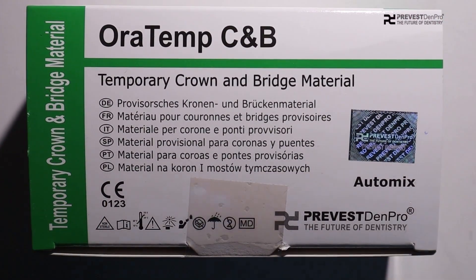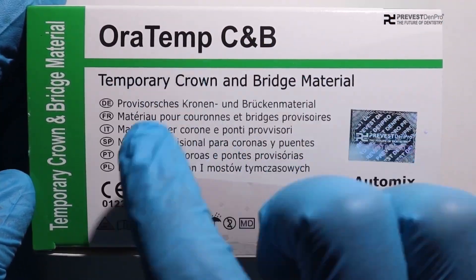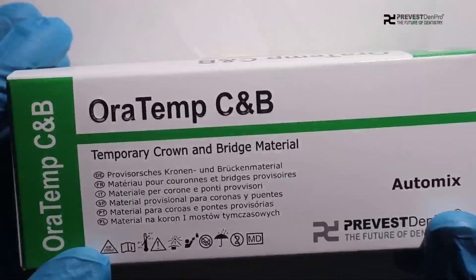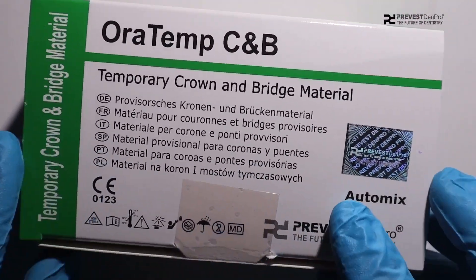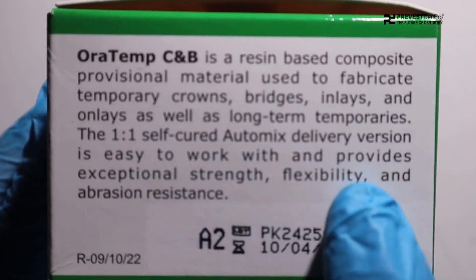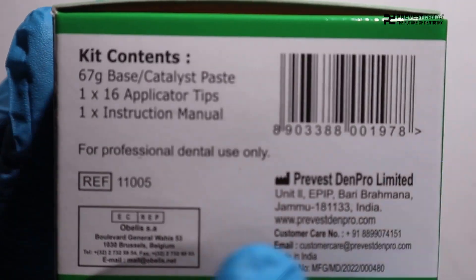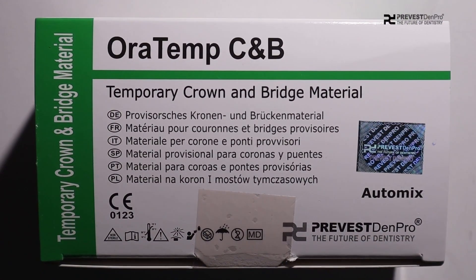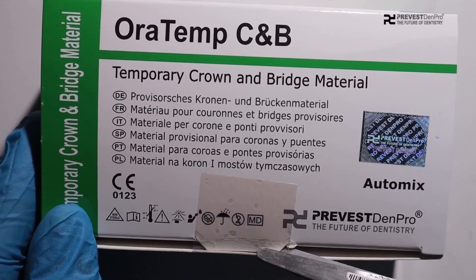Hi friends, today's video is about Oratemp C&B, a temporary crown and bridge material developed by Prevest Denpro. Oratemp C&B is basically a composite material used to fabricate temporary crowns, bridges, inlays, onlays, and veneers. This kit contains 67 grams of base and catalyst, 16 applicator tips, and an instructions manual.